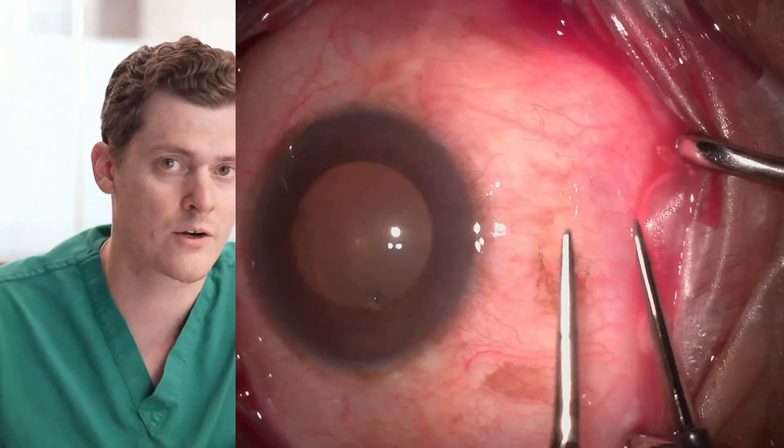However, some patients need surgery, and I'm going to walk you through our surgical approach that's minimally invasive, quick and easy on both us and the patient. We do a cautery technique.